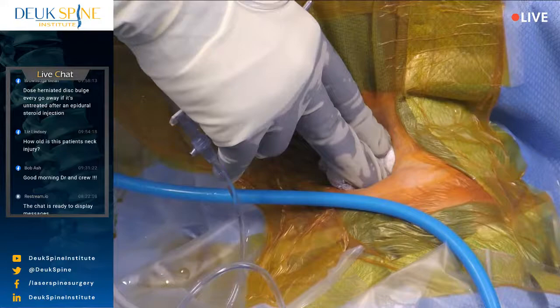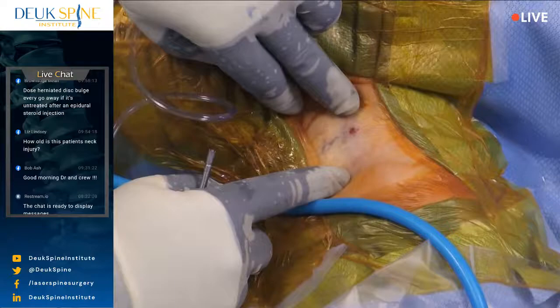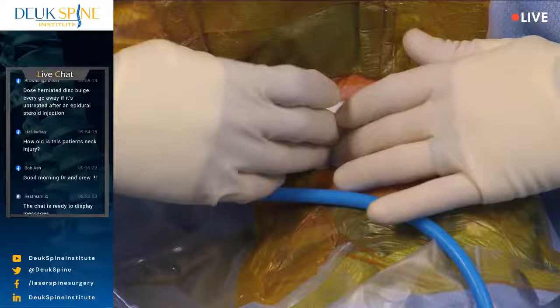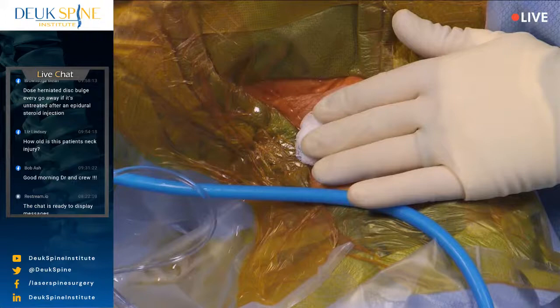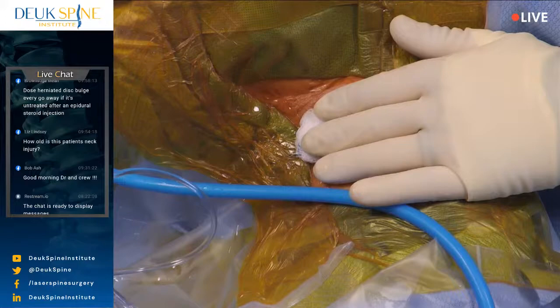Let me show you the incision. The incision is there. Can you see that, Zach? Right there? We can see it. It's a tiny incision, and the whole surgery is done through this little metal straw. All right, you guys, a little pressure, and we're done. Because her disc was completely destroyed and just a little bit in the back was where the herniation was, that's what we got out. It really came out mostly in the beginning. And like I said, in her case, she's got several degenerated discs, but we're only fixing the one today.